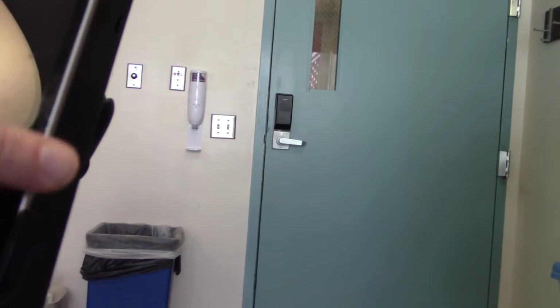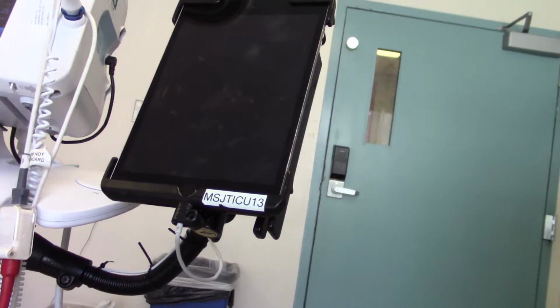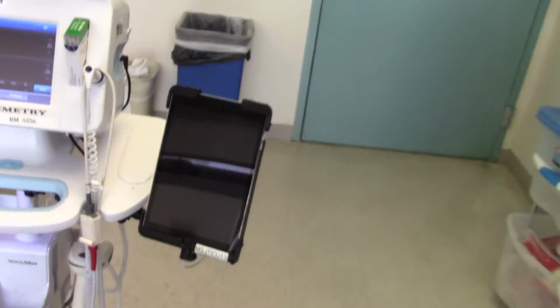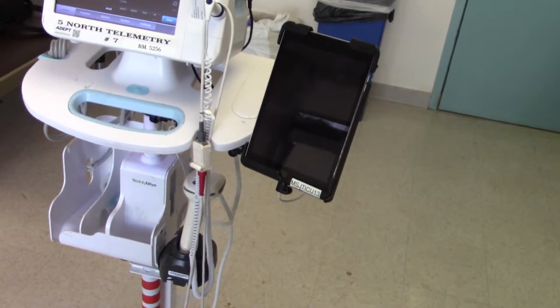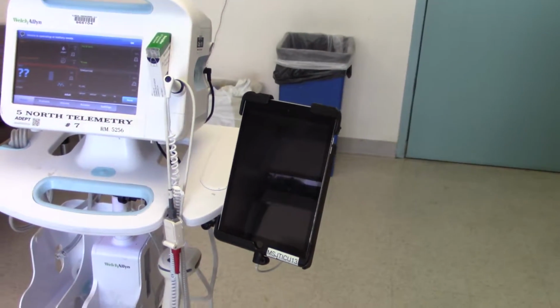So if you just had more of a bumper here. Yeah, if it had some sort of shock mounting around here, or if it was in some sort of a rubber sleeve, that would probably be enough to give it some degree of protection. Obviously, it's a glass device on the floor, so there's a good chance it's going to get damaged. Pretty good problem. Anyway, but we could mitigate a lot of that if there's a little more protection.